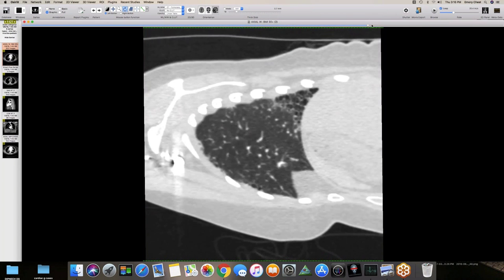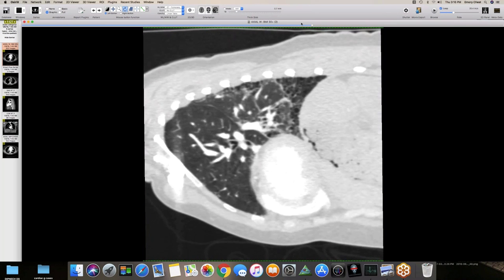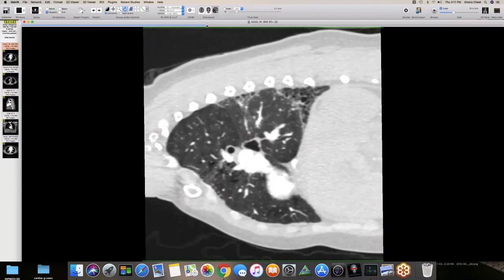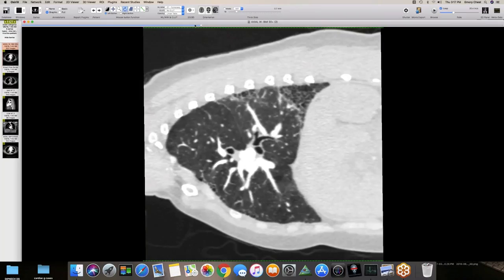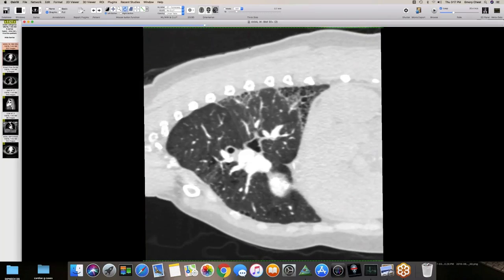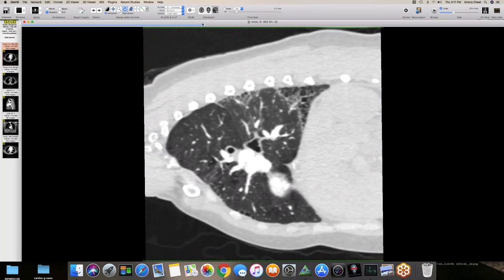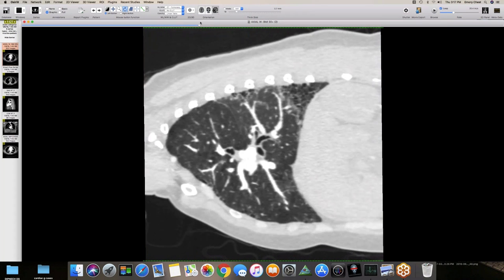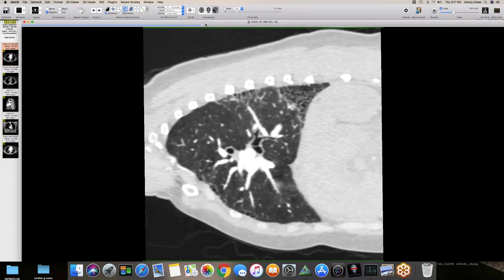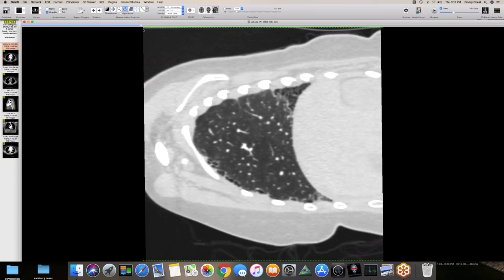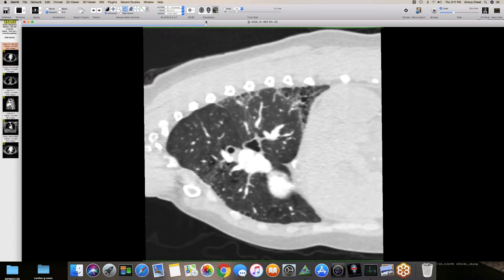There has to be some reason why — we're finding Jonathan's anterior upper lobe sign very commonly in these patients. The leading edge of the abnormality is very straight. What some people may call honeycombing is actually very heterogeneous here — another sign you're not dealing with classic UIP, as Jonathan has well described in his paper in AJR. Just a great demonstration of all those findings.